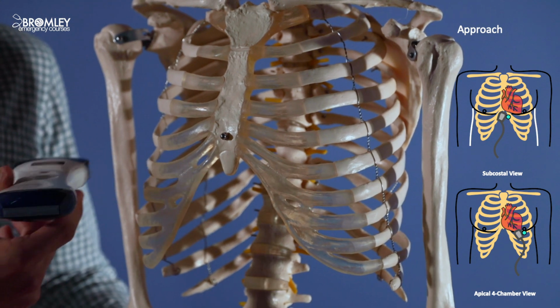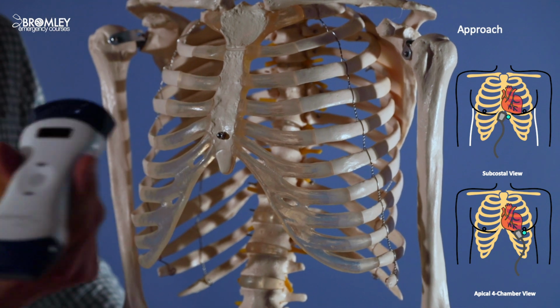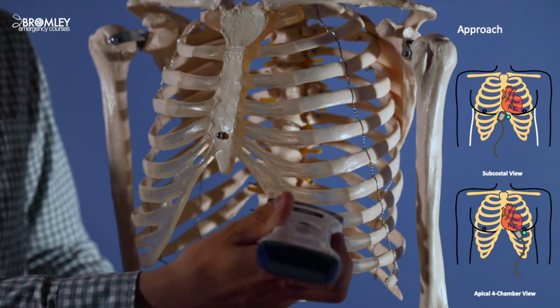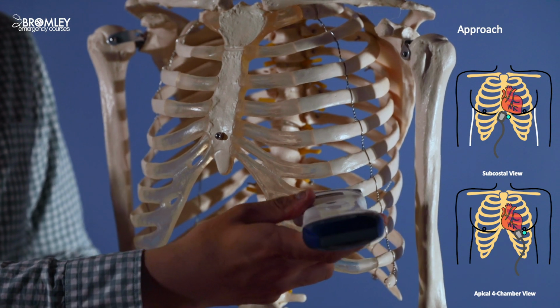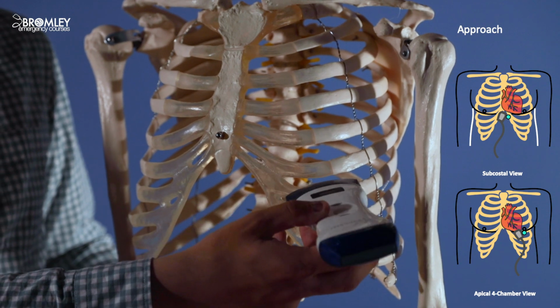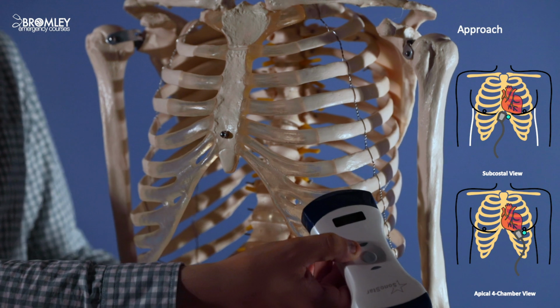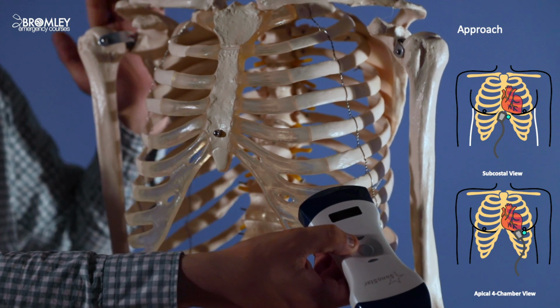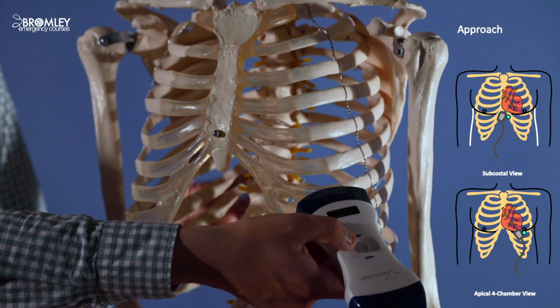When we talk about the apical 4-chamber view, we need to place the probe at the apex beat, so somewhere around here in your patient. Again, probe marker towards 3 o'clock on the clock face, and then we bring the tail of the probe down so that we're pointing the probe towards the patient's right shoulder, and this way we cut through all 4 chambers of the heart.